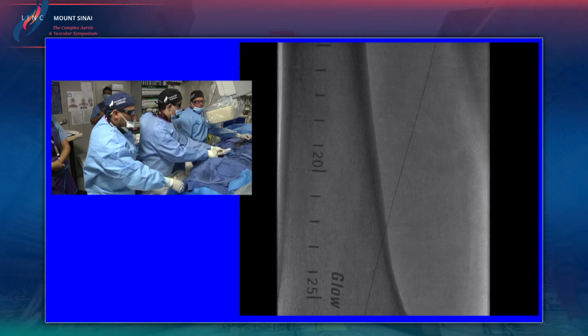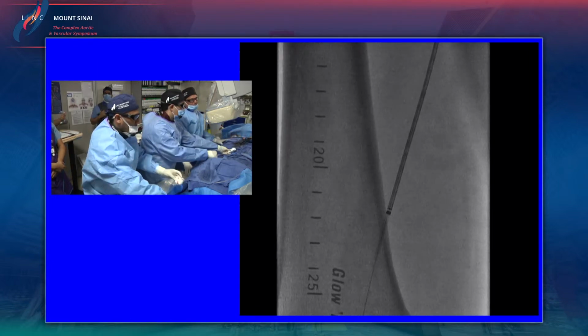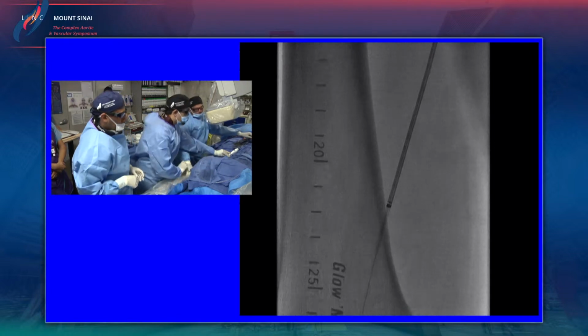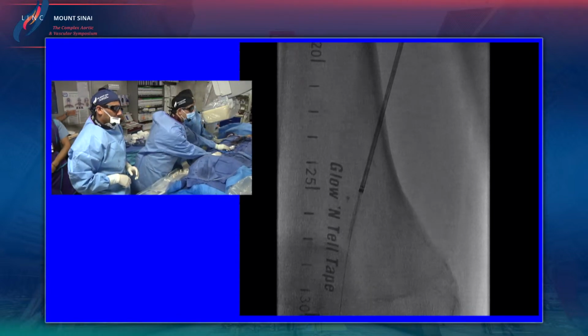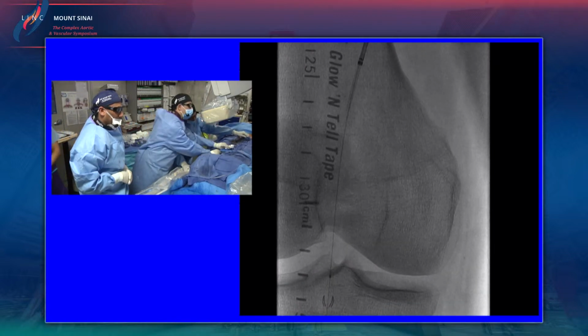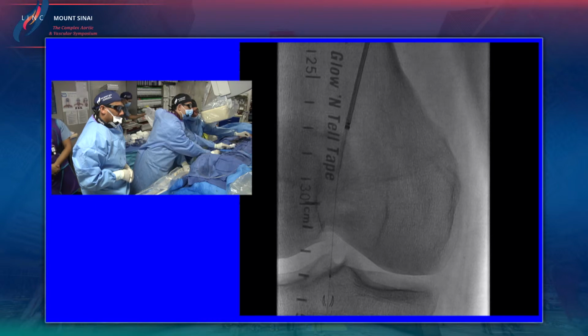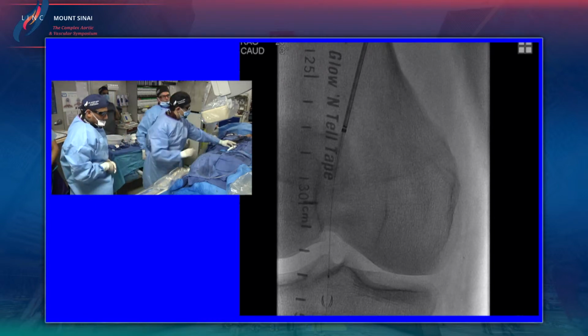It's going to get to the point of the Supera and stop. You've got that limitation. There's not much you can do with it. If your Supera itself looked okay, you may end this stent just into the Supera and then start from the proximal end of the Supera, rather than put nitinol inside there. All right, deploy. So we're going to go ahead and deploy this.